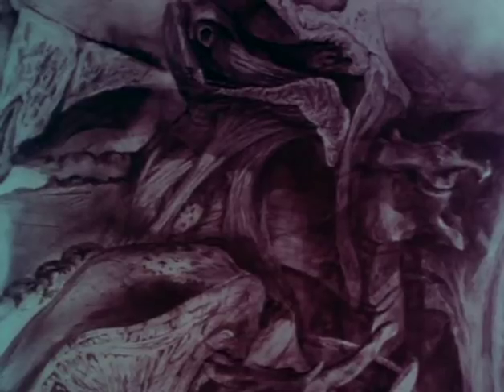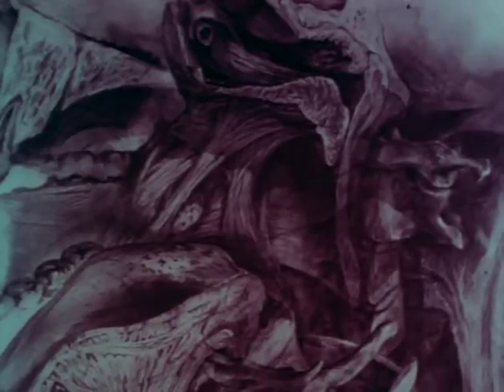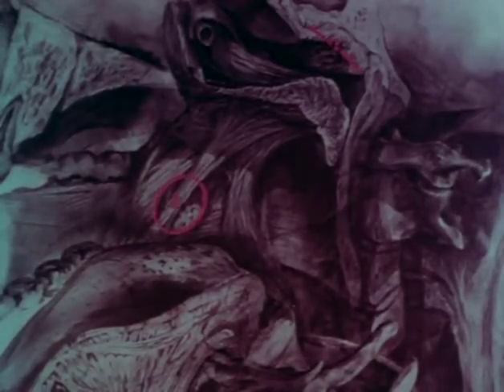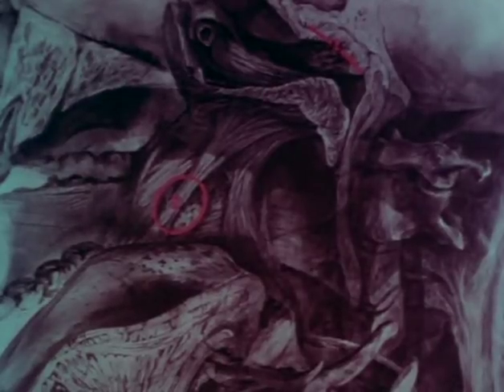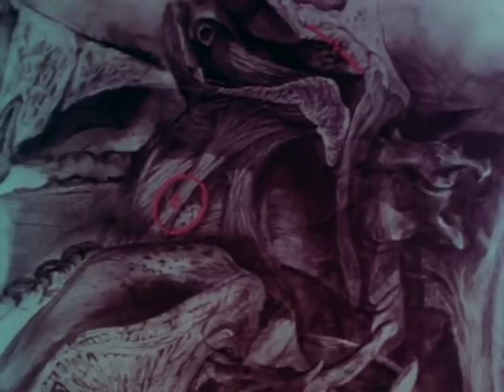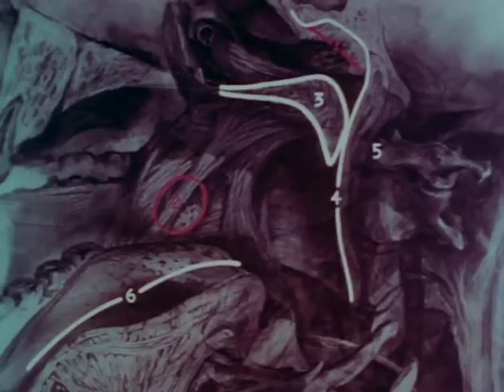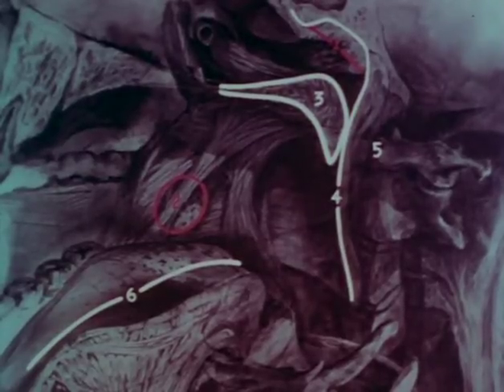14 anatomical components are considered essential in the routine radiological and physical examination of a preoperative T&A patient. Number 1, adenoidal area. This lymphoid tissue will vary greatly in mass, as we will see. The area is critical during phonation in children with slight velopharyngeal incompetencies. Number 2, the tonsils. Number 3, velum. The size, shape, and placement of the velum is also critical.